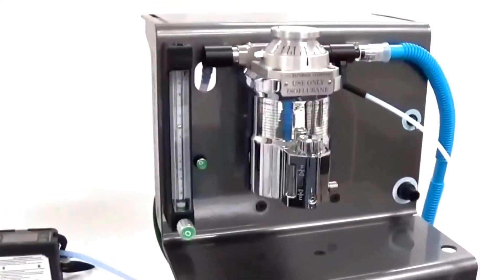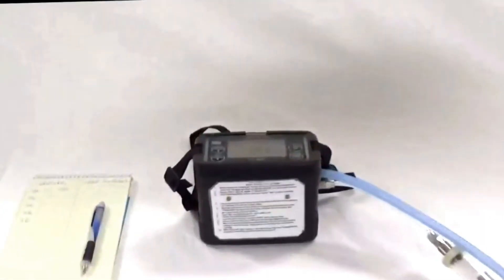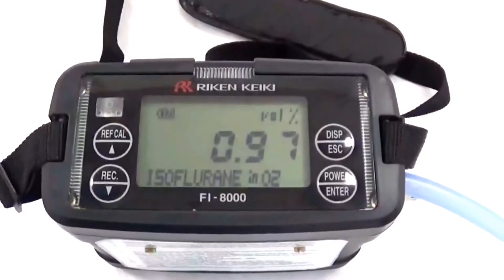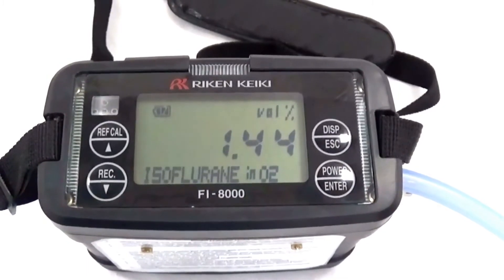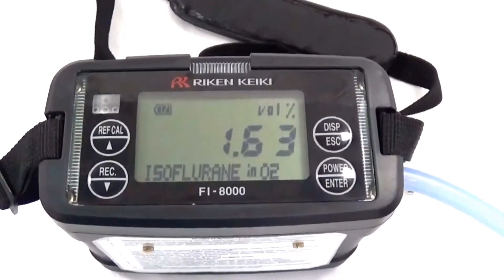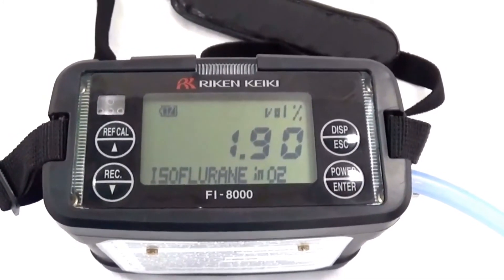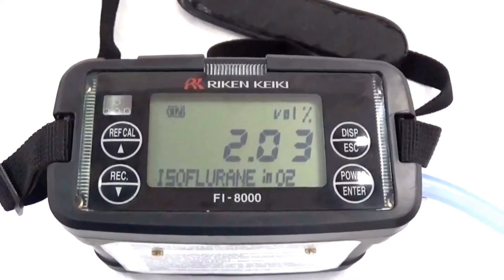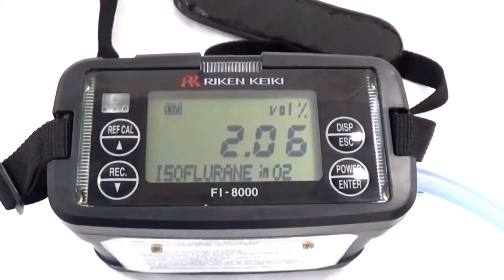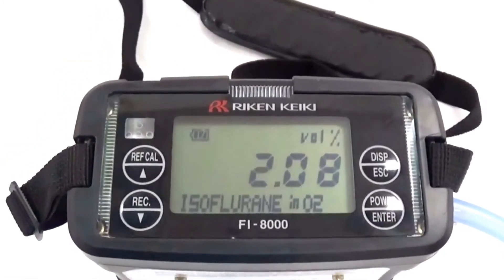We will now adjust the vaporizer to 2% and wait until our number stabilizes. This could take a few seconds. The pump runs constantly, so no need to try and turn it on and off. We are at 2.07, 2.08. We will record the 2.08 value.